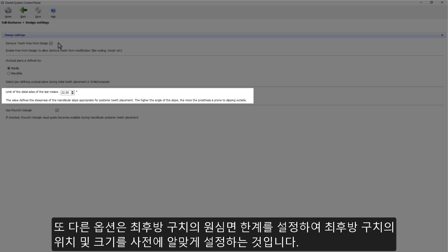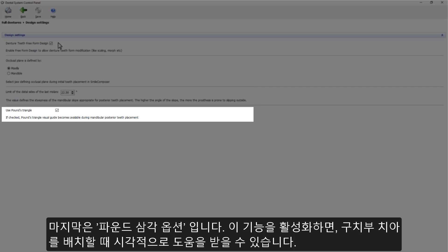Alongside, you have the limit of the distal sides of the last molars, which helps to predefine reasonable dimensions and the positions for those teeth. And use Pound's triangle. Enabling this option makes the Pound's triangle visual guide available while placing posterior teeth in the mandibula.